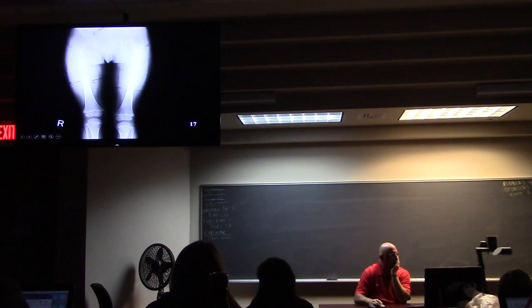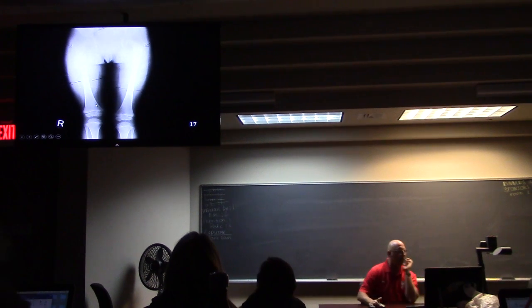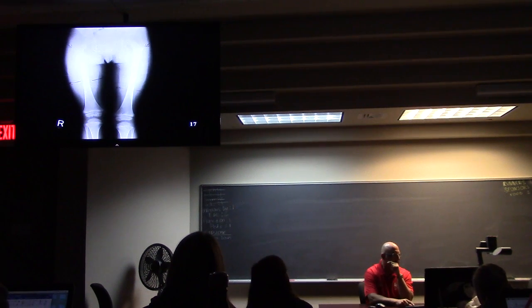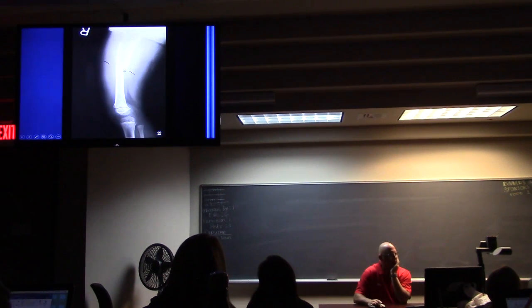Can you guys see this stripe right here? Oh, come on. There's a white stripe. It's much whiter right there. Oh, yeah, it's a white stripe. Golden rule: one view is no view, right? Same girl, new view. Oh, wow. Everything lined up perfectly. That white stripe is where the two bones are on top of each other.